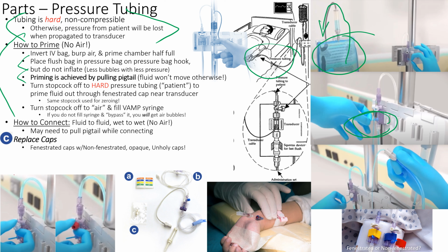If you want to defenestrate someone, you throw them out the window, right? That's what they do in Russia, right? You defenestrate somebody, that's an open hole, right? So fenestrated means holey, and then there's the non-holey one, or the unholy, right? So we have the unholy caps and we have the holy caps, right? This one comes in the kit, and this one comes on the line itself, right? So this is the fenestrated one. You can see the difference on those two, right?